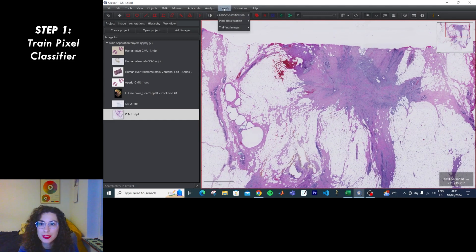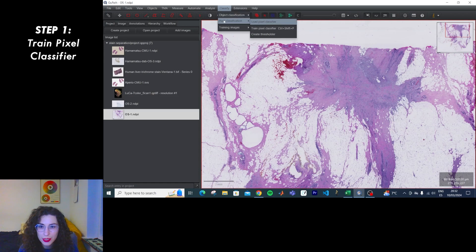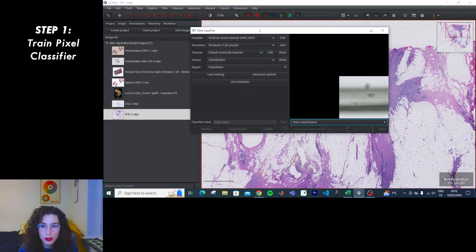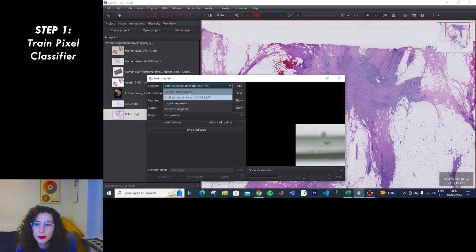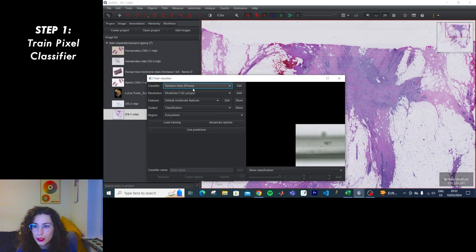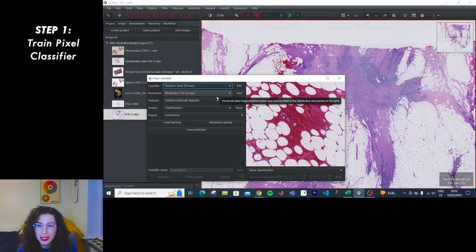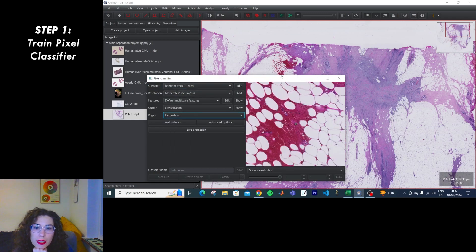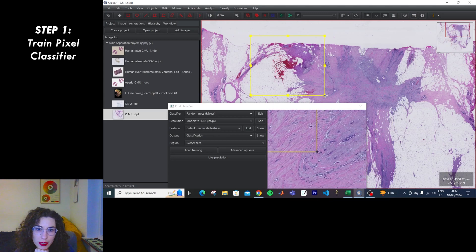So this time it's Classify, and instead of object classification, pixel classification, and then we're going to train one. Let's start with something a bit more simple — Random Trees. Resolution: moderate. I don't want this to take forever. Let's do a small region first to try things out.